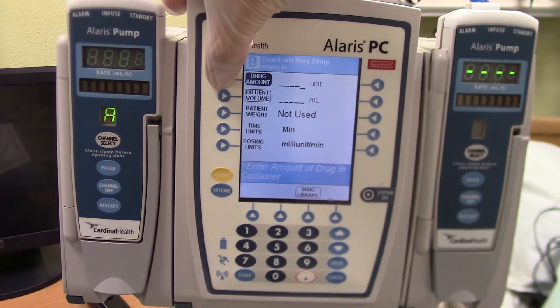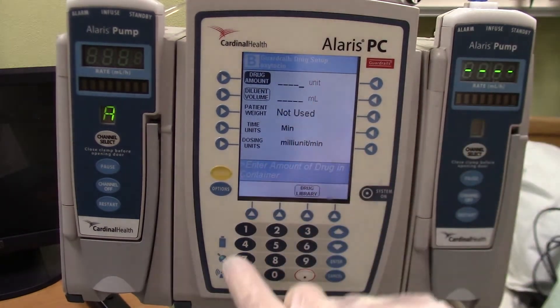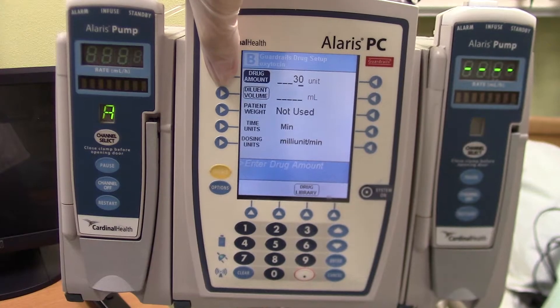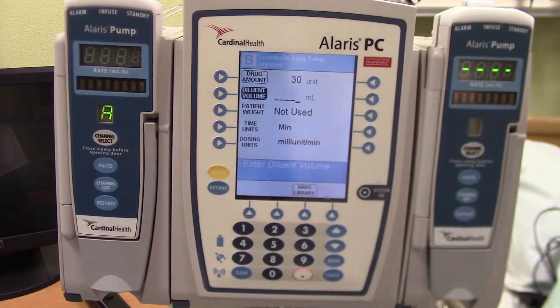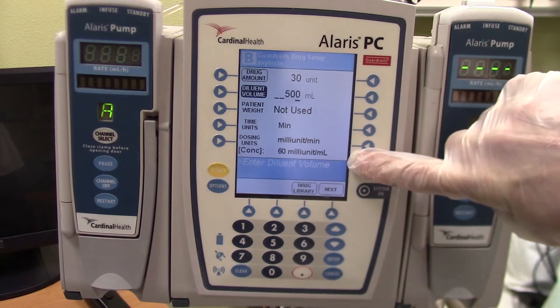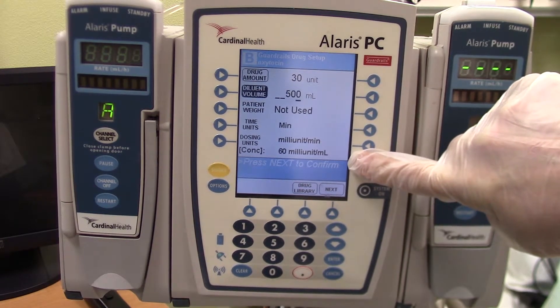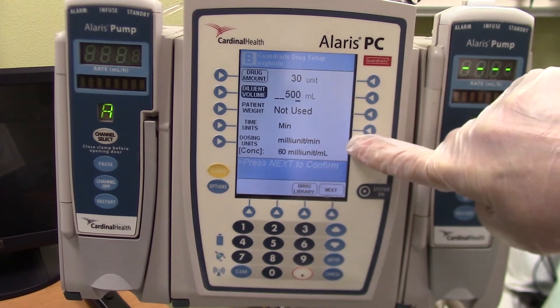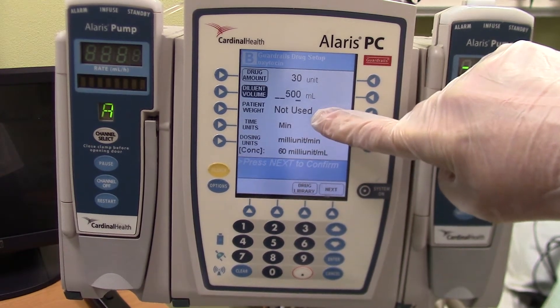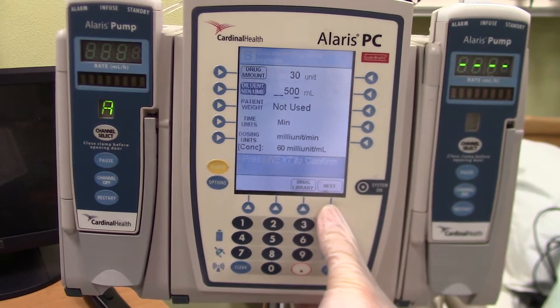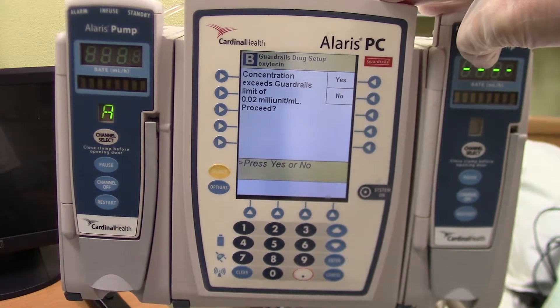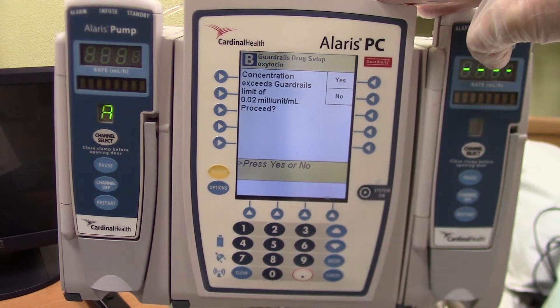I've selected drug amount, and then I need to put in the number using the pad below: 30. Then I can go and select the diluent volume — it is 500. So it's calculating here that I have 60 milli-units per milliliter. The dosing is already selected: milli-units per minute, time units of minutes, and patient's weight is not used. At the bottom I see a next — I'm going to select next. Now it's giving me a warning.